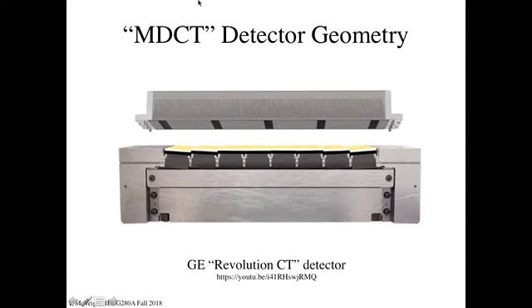This is a panel, one of about 12 or 13 panels of X-ray detectors in that GE scanner. These are the elements that actually flash when an X-ray hits them. It gives off a fluorescent flash, and then it's changed to a voltage that goes down to a preamp. This structure up here is an anti-scatter grid.